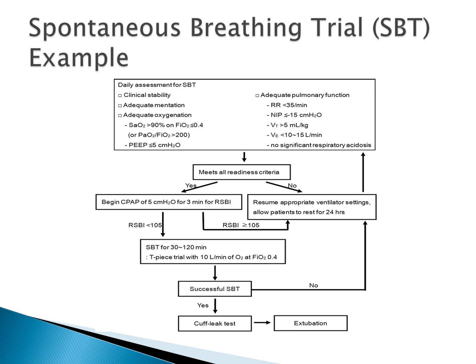So you're looking at other elements. What is their mental status like? This is also in the top portion. Adequate oxygenation: you're looking at pH, PCO2, PO2, P to F ratio, oxygen index, and things along those lines. And then looking at the pulmonary mechanics. When you actually put them on either a tube compensation mode on the ventilator or a very low pressure support and PEEP, what are the mechanics like?